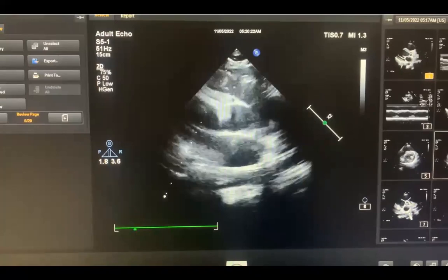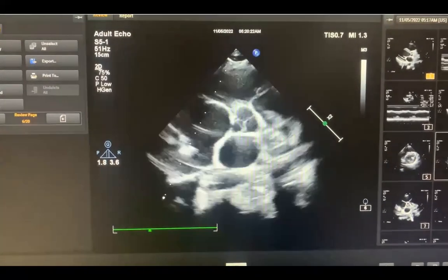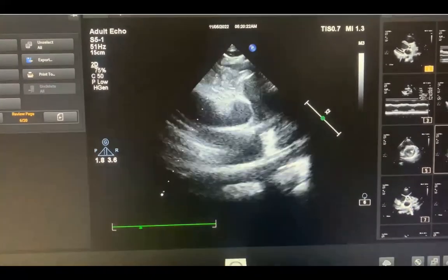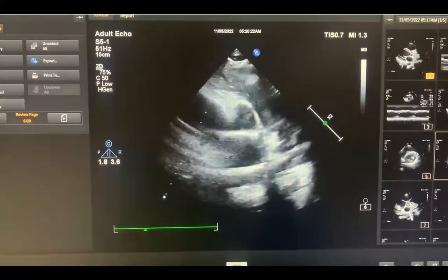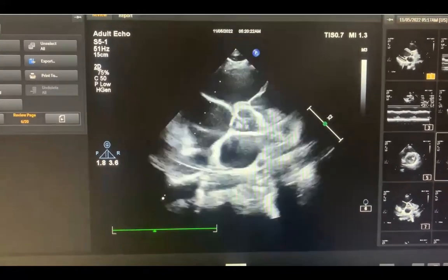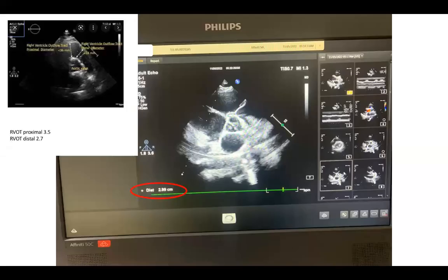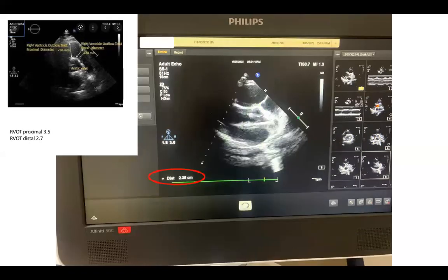Before going to the parasternal short axis view, I advise you to go to the RV inflow and take a continuous wave over the tricuspid valve. After this, you rotate your probe and get the parasternal short axis view at the level of the great vessels. You can measure the RVOT proximal, which in this case is 2.99 cm (normal up to 3.5), and the RVOT distal, which is 2.38 in this case (normal up to 2.7).